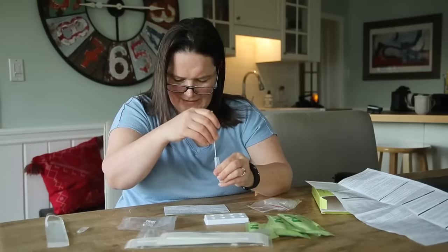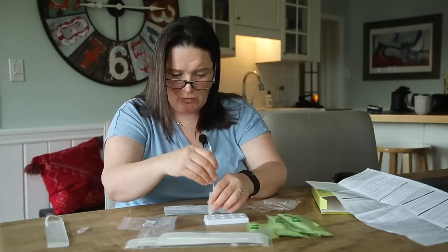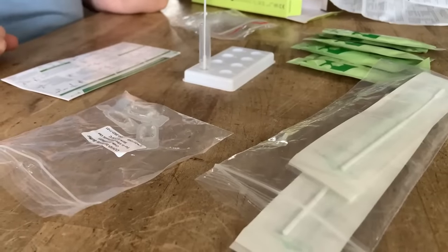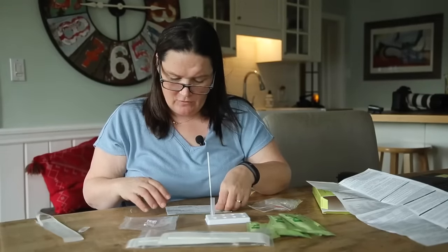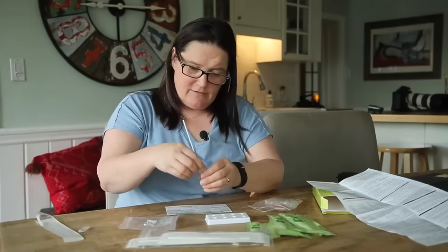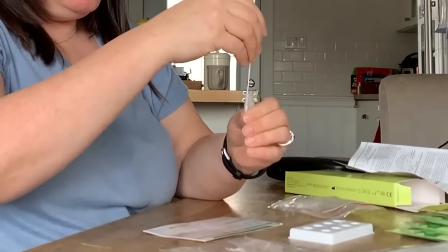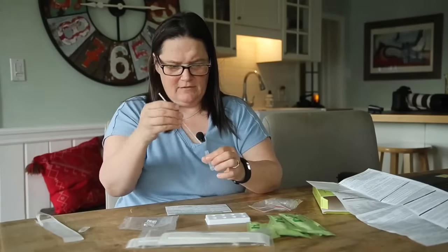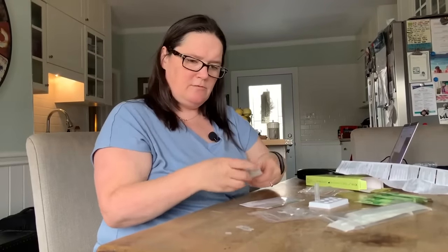With the swab still inside, securely place the extraction tube upright into the tube stand and let the swab stand for two minutes. Remove the swab while pressing the head firmly against the inner wall of the tube to release as much liquid as possible. Dispose of the used swab in accordance with the appropriate biohazard waste disposal protocol — I don't think very many of us have those yellow containers in our homes, but you know. So I'm going to squeeze all the juice off of this thing and put it back in here.